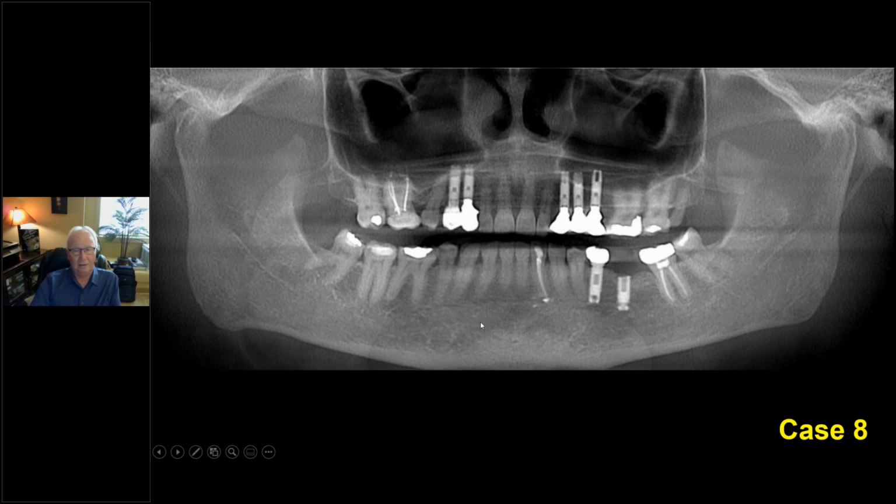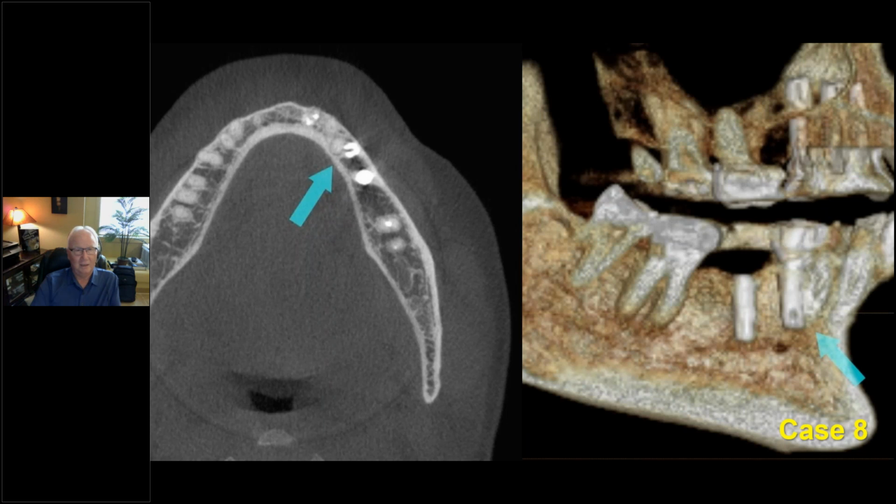It's kind of like you're in dental school. If your impression wasn't proper when you took it the first time and you didn't retake it, everything goes downhill from there. So here's another one. This implant looks like it's in a pretty good orientation. It's got good height. I can barely make out the canal, but it looks like it's at a sufficient distance from it. They've had successful implants placed in the maxilla. So let's look at this one.